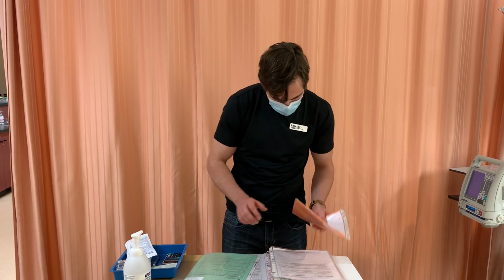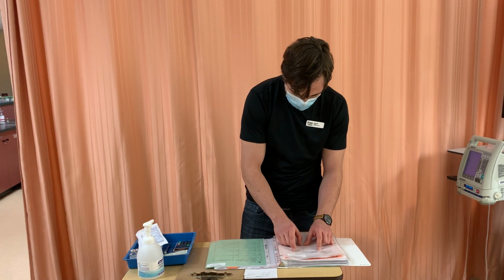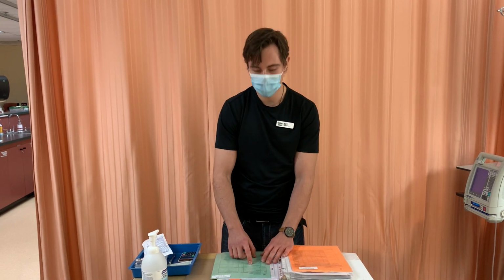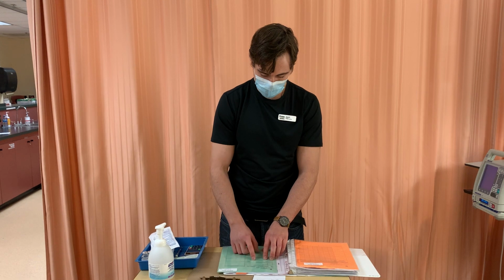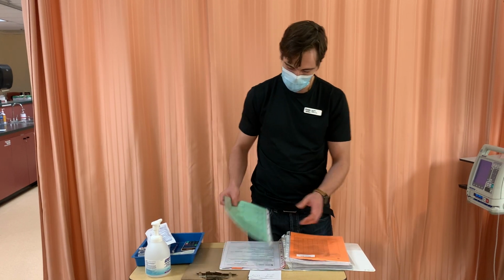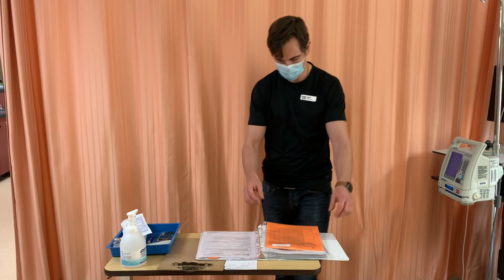And so we're going to be giving Vancomycin today because our patient has been admitted with cellulitis on her left arm. I'm going to note here that we do have a primary infusion running right now of normal saline at the IV at a rate of 25 cc per hour, continuous infusion. I have gone over the physician's orders and they do match our MAR.